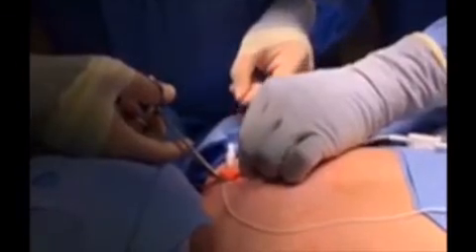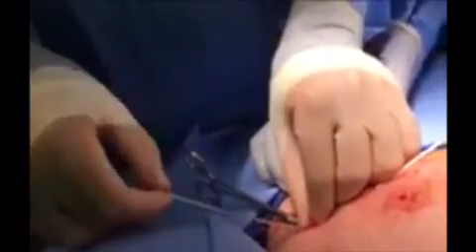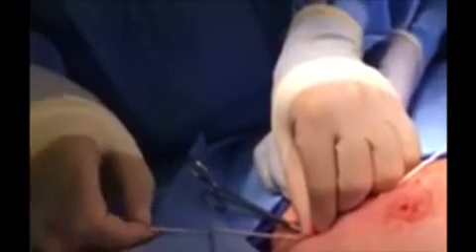Most of us usually guess by approximating over the chest wall, but instead we can use the wire mark technique to know exactly where to cut the catheter. The wire is removed and the dilating sheath is clamped. The distance from the tip of the wire to the kink is measured — in this case we laid it over the catheter. We then cut the catheter to the exact same distance. The catheter is placed through the dilating sheath and confirmed to be in perfect position on fluoroscopy.